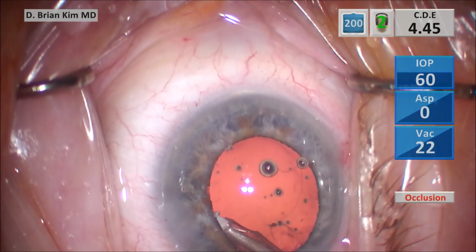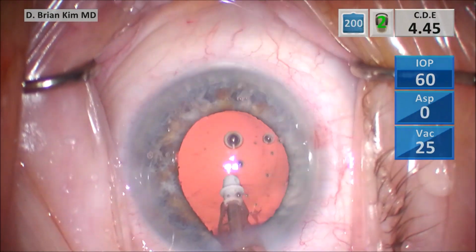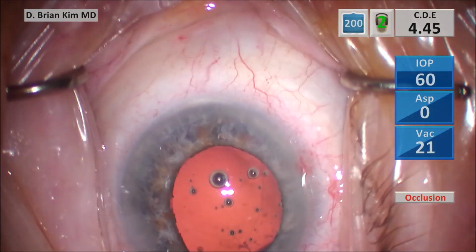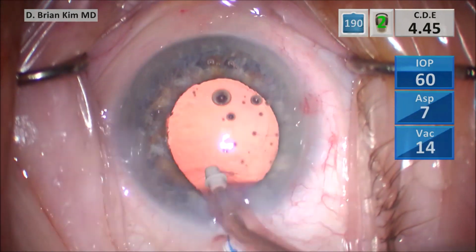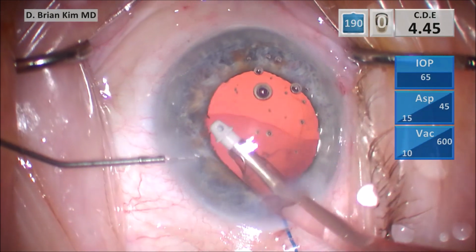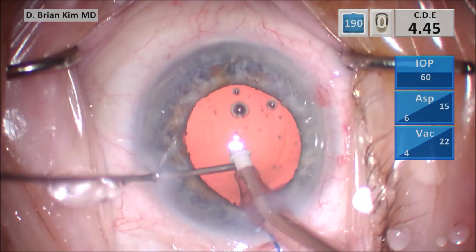So there's a little bit of zonulopathy in this case as well, as I suspected. When I get to the subincisional area, there's some fine material there I'm polishing off as well. And there's quite a bit of subincisional fine cortical material there. Trying to peel it with the polymer tip, but I might have to flush it. So this is the BSS cannula. I'm going into the subincisional space. And let's see if I'm able to pulse that material out. There we go. So some of that's coming out there.